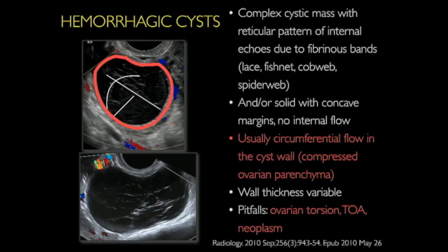So there's a lot of talk about, and it was mentioned in many other talks, the consensus conference in 2009, which came up with the criteria for the benign anechoic unilocular cyst for adnexal imaging, but at the same time hemorrhagic cysts were also discussed and recommendations were made. And it was very important to recognize that when you're talking about recommendations or criteria, we need to have the same criteria so that we know we're dealing with the same process.